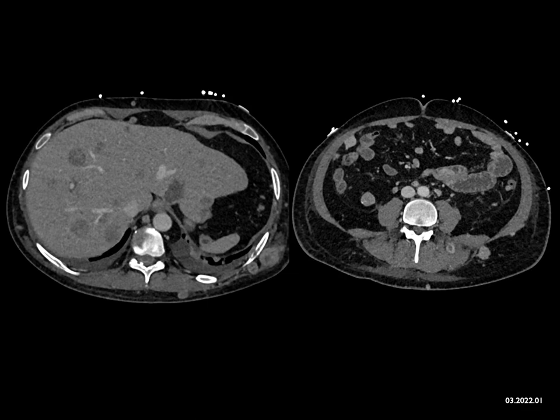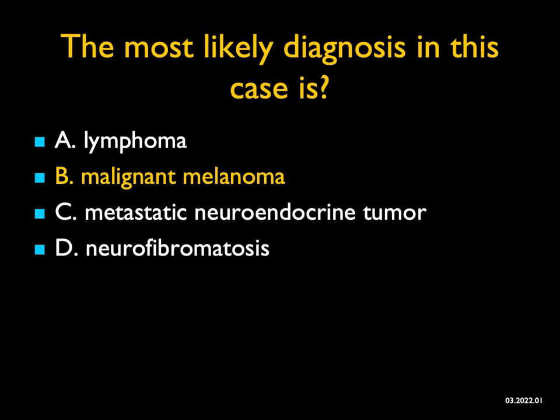With the lesions in the subcutaneous tissues, lymphoma or melanoma can both be good. I will admit when I see so many organs involved — particularly that small bowel, as well as muscle, subcutaneous tissues, and liver — I'm going to go with melanoma. Obviously it could be lymphoma, so I'd give you half credit, but melanoma is the best answer.